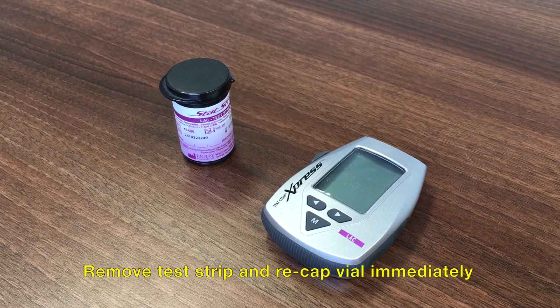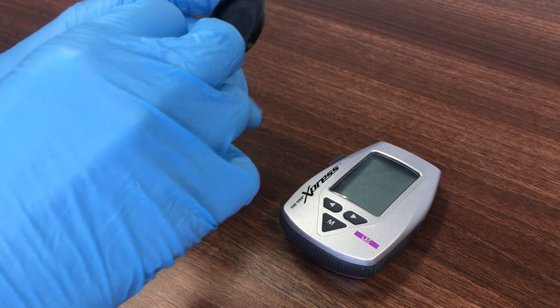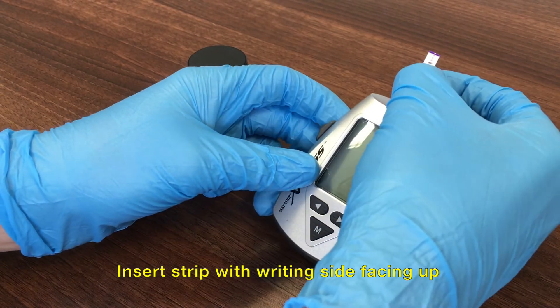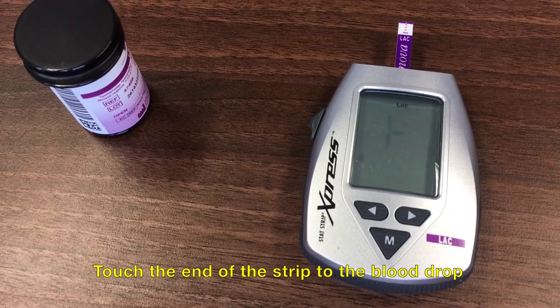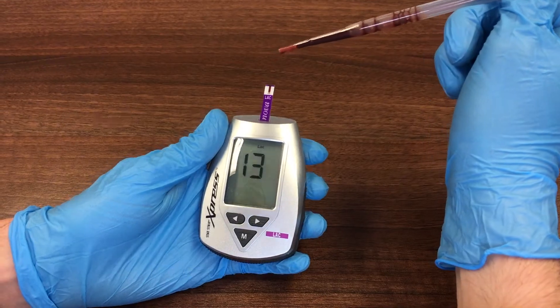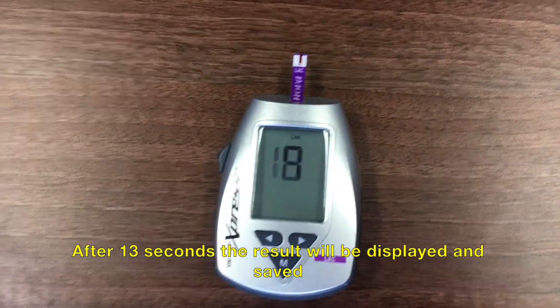Remove a test strip from the vial and recap immediately. Insert a test strip into the meter with the writing side facing up and wait for the flashing blood drop icon to be displayed. Touch the end of the test strip to the blood drop until the test strip fills and the meter beeps. After 13 seconds, the analyzer will beep and the result will be displayed and stored in the memory.